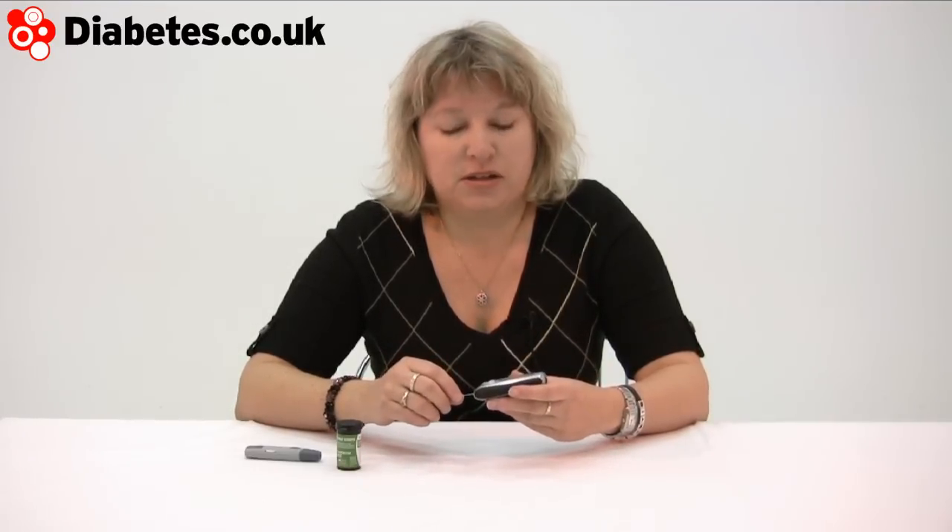It's very highly accurate. The WaveSense Jazz uses patented technology and is coming at blood testing from a slightly new angle. What it's designed to do is address how everyday events and conditions can cause a meter to distort the result — so that might be cold, humidity, and other factors like that.